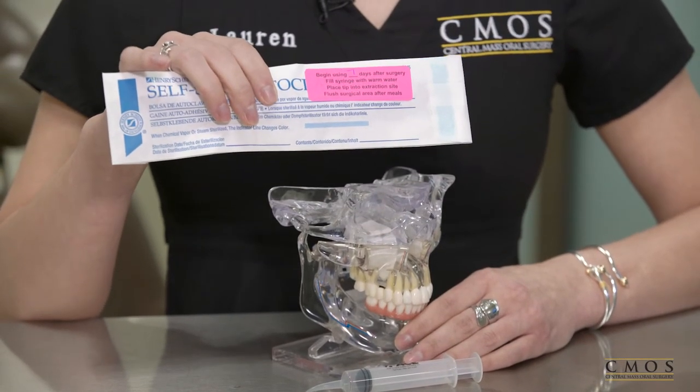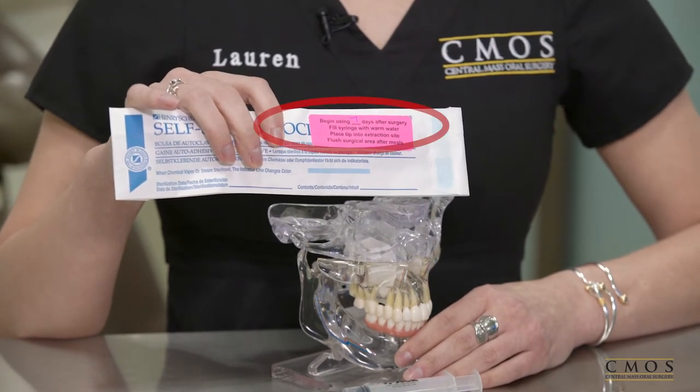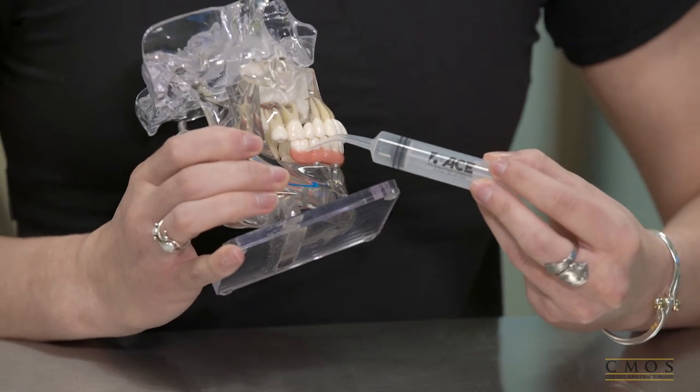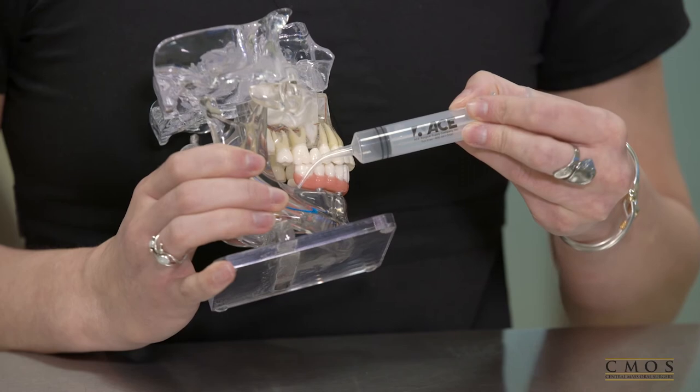With a neon sticker like this one — on the sticker it will instruct you to begin using the syringe either five or seven days post-op. What you will do with the syringe is fill it with room temperature water, then take the tip of the hook syringe and place it into the extraction site.